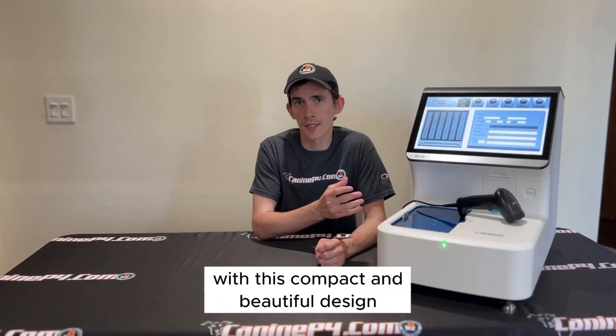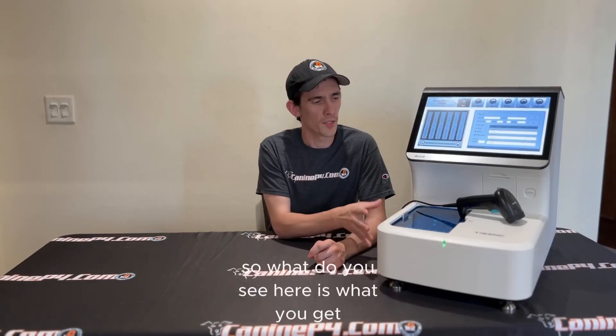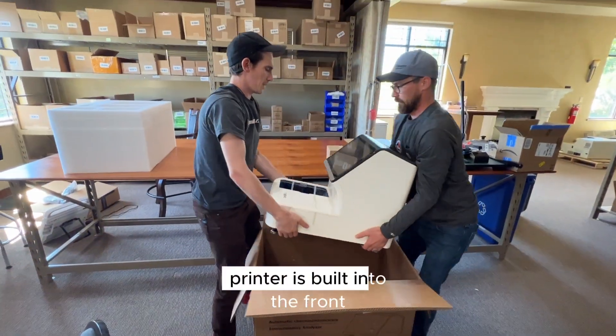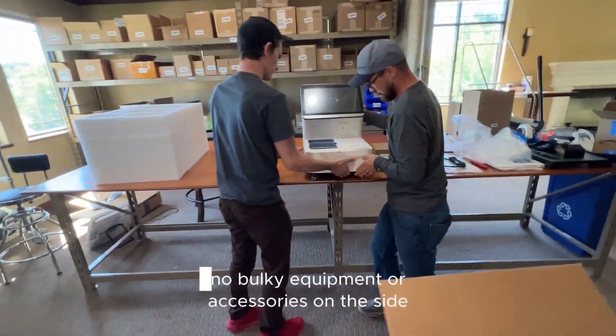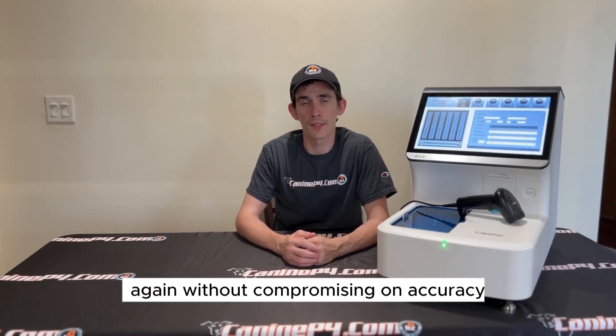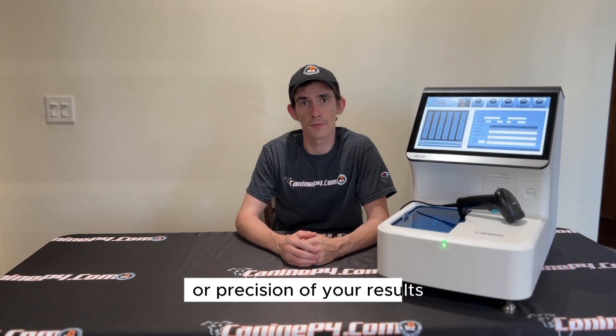With this compact and beautiful design, it's also going to save you on space. What you see here is what you get — printer is built into the front, LIS compatibility in the back, no bulky equipment or accessories on the side, without compromising on accuracy or precision of your results.